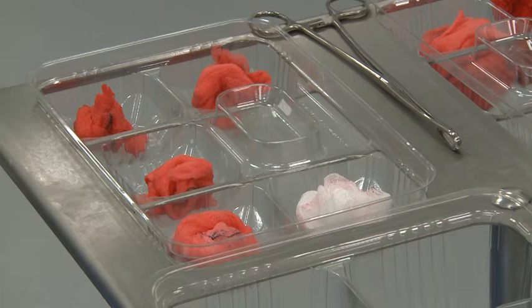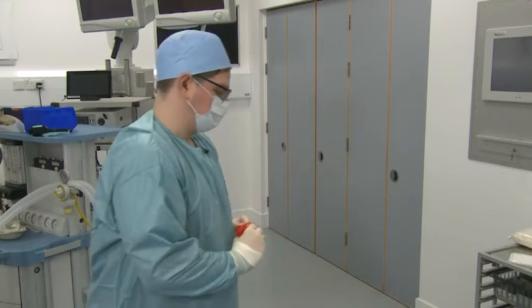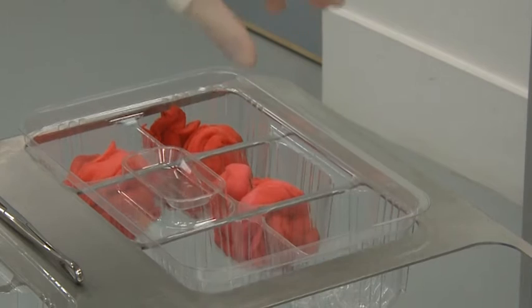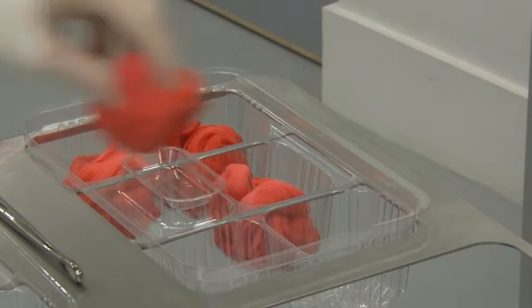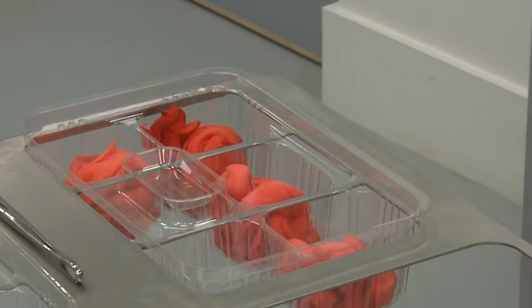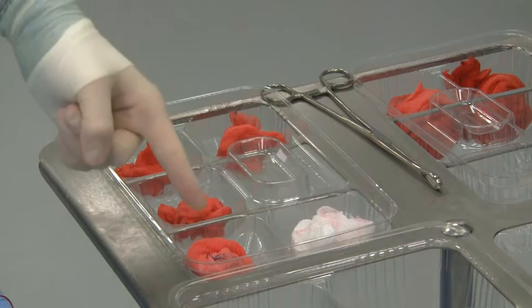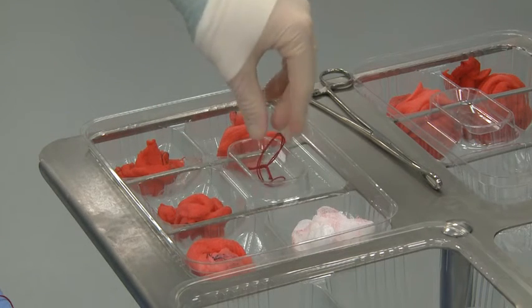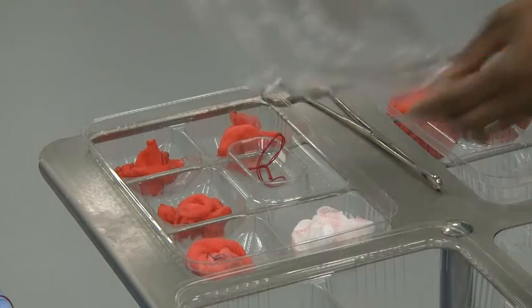Each Swabsafe container is divided into 5 sections, with an additional dish for the placement of the red tie. The scrub practitioner directly discards each dirty swab into an individual section. Ensure the swab is fully contained within the section and does not overlap into other sections. Once all 5 sections are used, the swab tie is added to the red tie dish in the container.